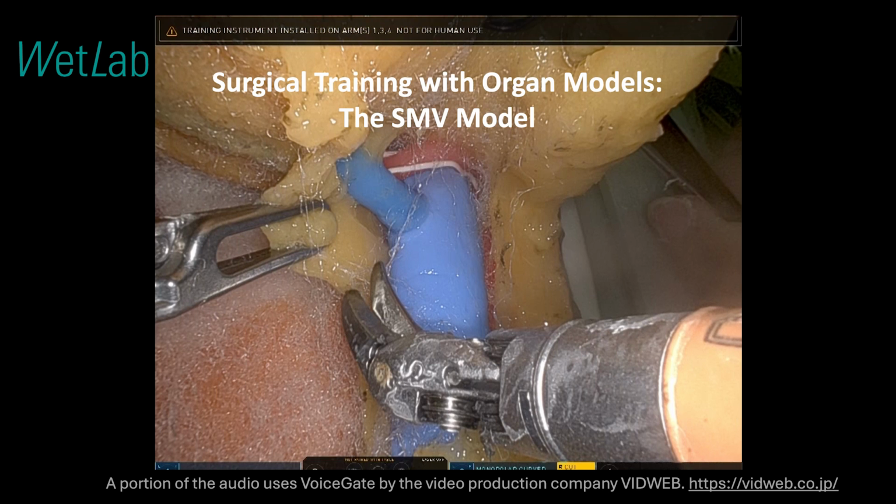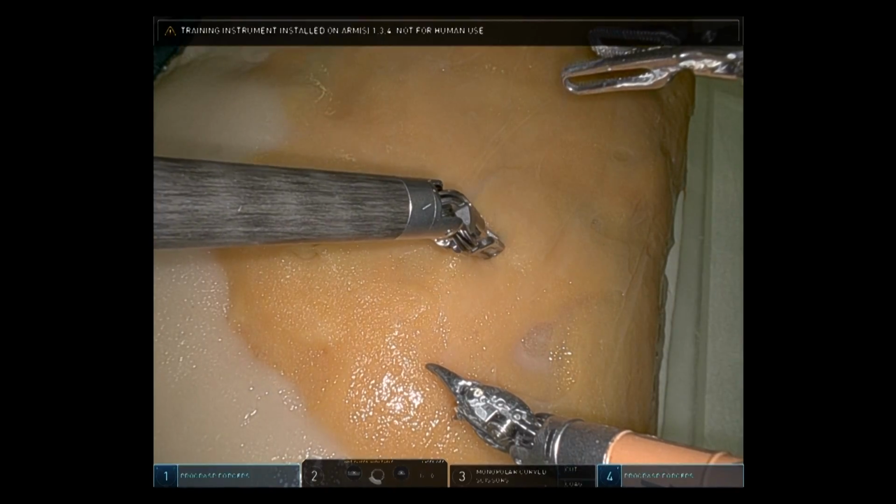This is an introduction to the SMV surgical simulation model, developed in collaboration with WetLab Inc. A representative surgical procedure will be demonstrated. Please conduct the simulation in accordance with your institution's standard approach.